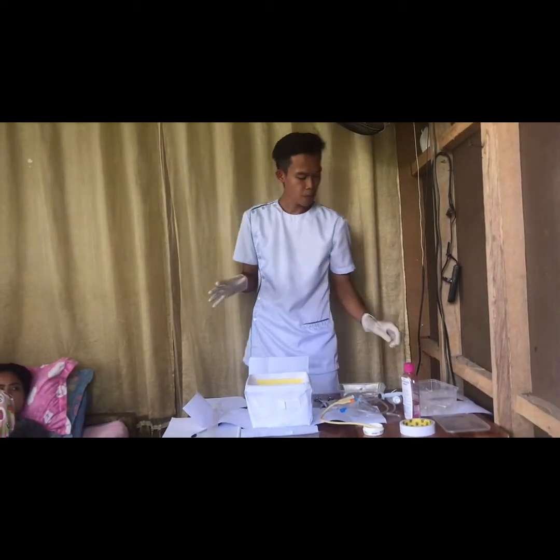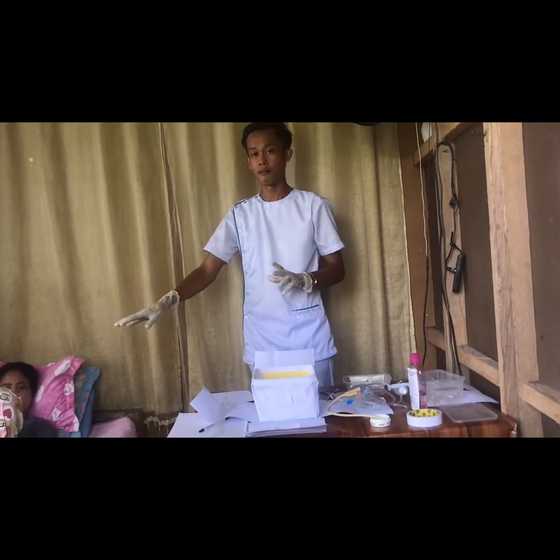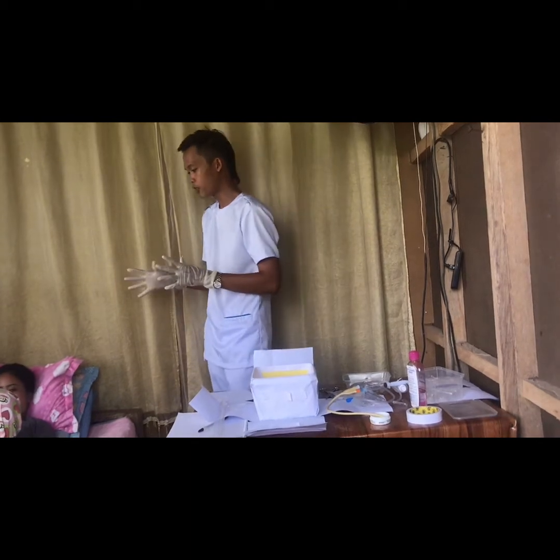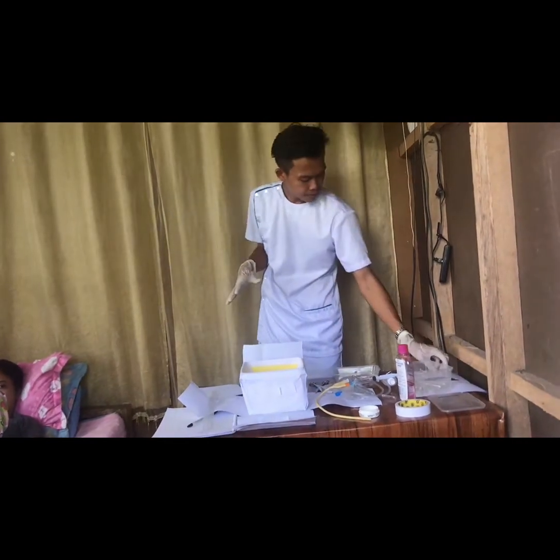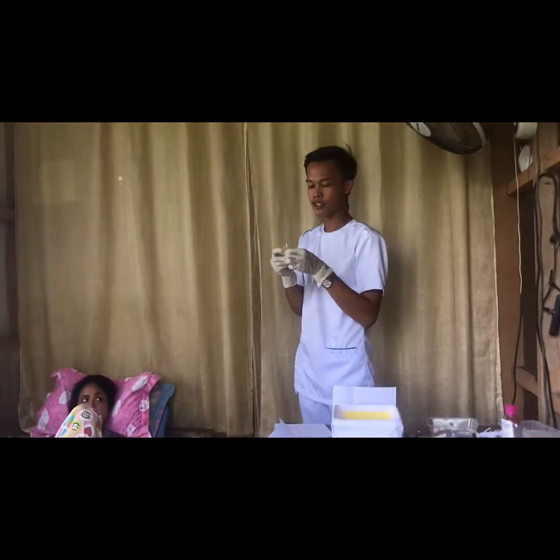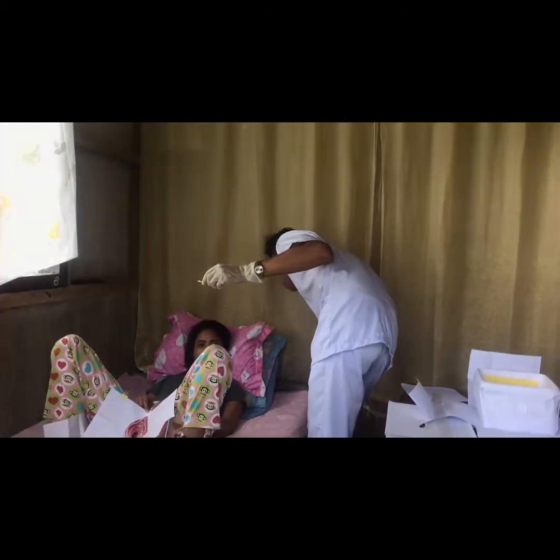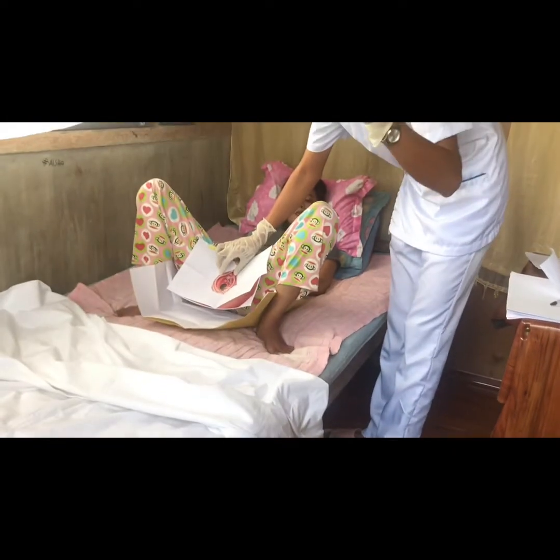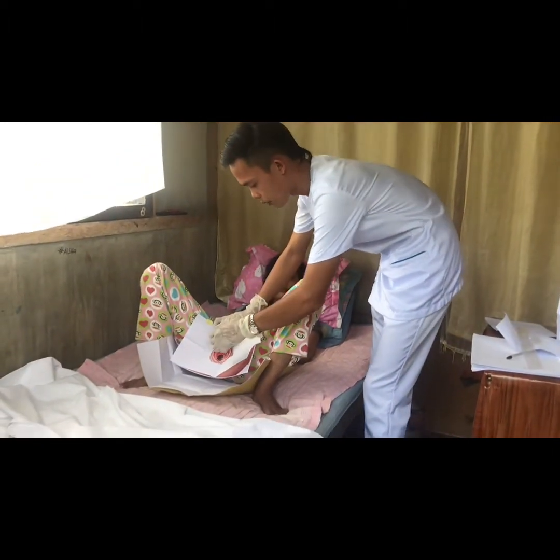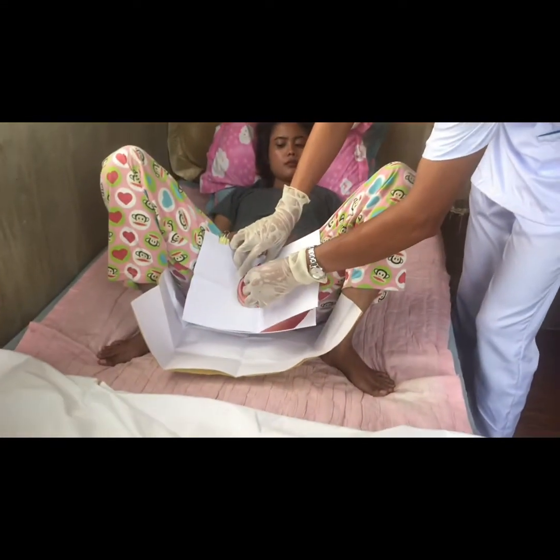Okay, so this time I'm going to use the alcohol swab to clean for the second time the private part of the patient. So now, ma'am, I'm able to have the second stage of cleaning. Is that okay with you? Yes. Okay. So I'm going to clean with the alcohol swab. Okay. I'm going to use this one, and we are going to use our non-dominant hand in order to spread the labia, and then we are going to use this alcohol swab to clean the left and right portion of the labia here, and then dispose of it.